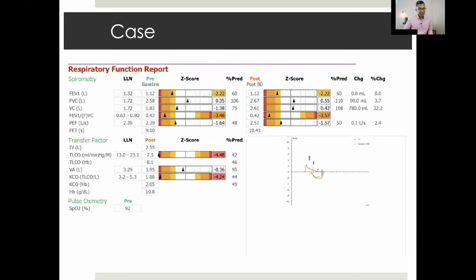What do you reckon? My FEV1 to FVC ratio is 0.43, so I've got severe obstructive disease. Just to clarify, you've absolutely got obstructive disease, but they don't really use the FEV1 to FVC for severity. Of course, yes. The FEV1 is 60% predicted, so it's moderate on the GOLD classification, between 50 and 80. Is that right? Yeah, that's right.